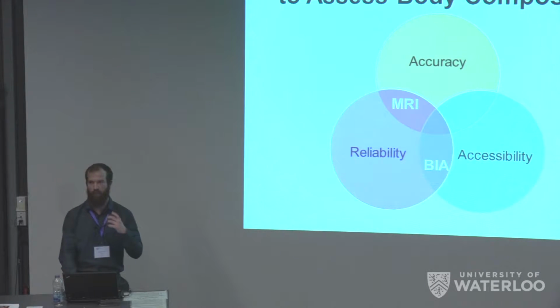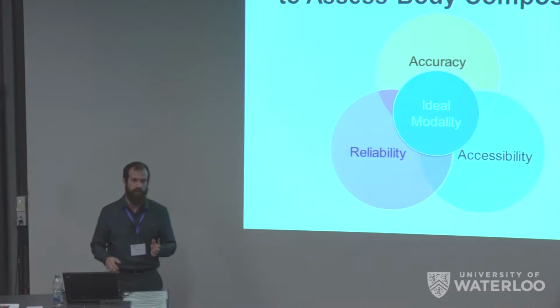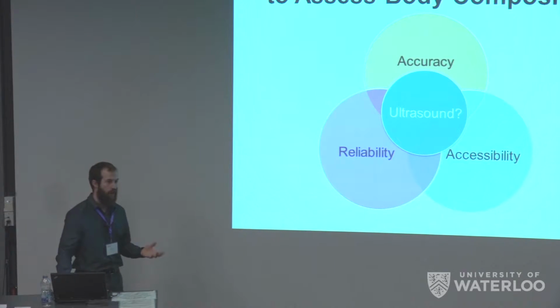And so when you think of what would be the ideal modality, it's probably going to lie somewhere in the middle, in which it's not as accurate and reliable as, say, MRI, but it's much more accessible, especially during those crisis times. And so one modality that is emerging that might fit this criteria is ultrasound, but there are still a lot of questions around it.